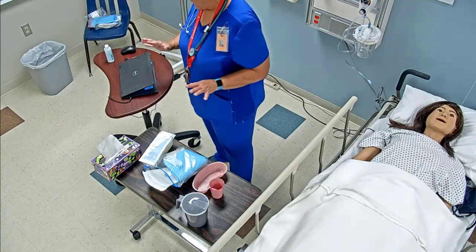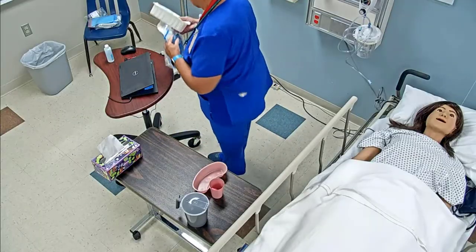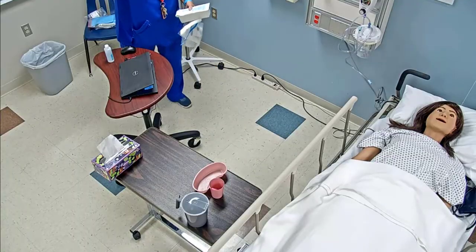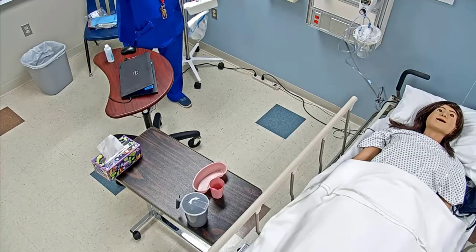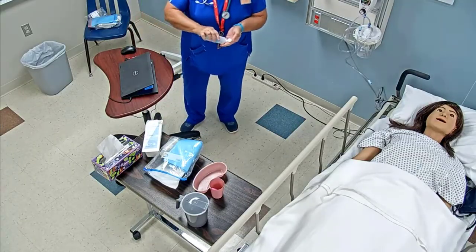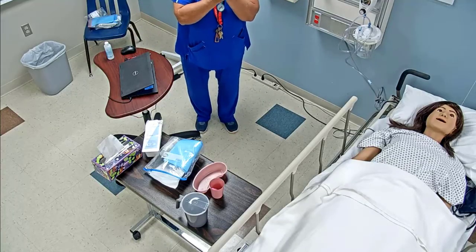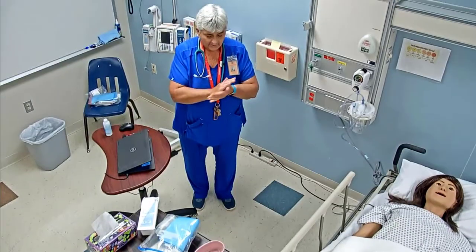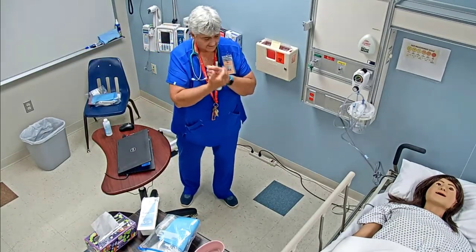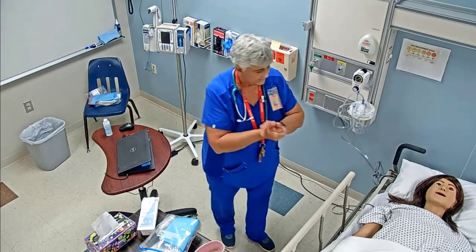So now that I've got all that, I'm going to take my supplies and step right over here for just a minute, and we're going to the patient's room. I'm going to knock on the door as I enter. I'm going to do a medical hand wash. At the lab in Levelland, you would get your hand sanitizer. So we're going to wash our hands, and as I do that, I'm going to introduce myself.